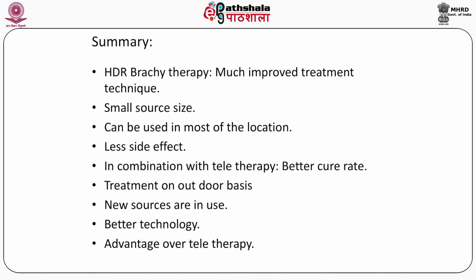Treatment is on an outdoor basis. Because of the high dose rate, treatment time is very less. The patient can come and be treated on the same day and be relieved from the ward on the same day. So on an outdoor basis, the patient can be treated.